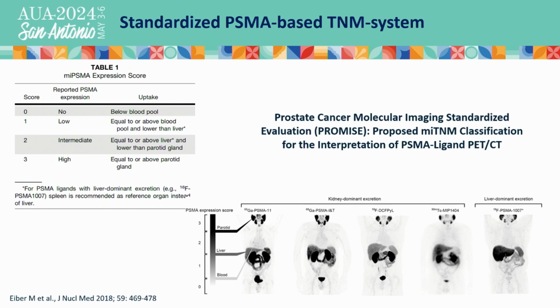And these different scores report the PSMA expression at different anatomic localizations. Usually if your SUV is below the SUV of the PSMA expression in the bloodstream, you know this is not due to metastatic disease. When it is equal to the blood pool or lower than the liver expression, you know this is not metastatic disease. And using these different scores, you can have a look at the different PSMA PET scans.